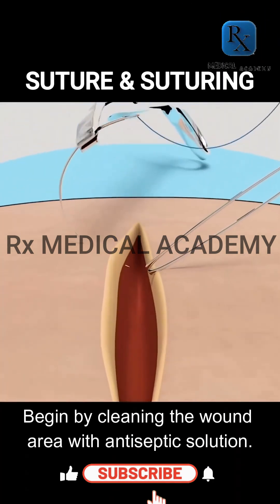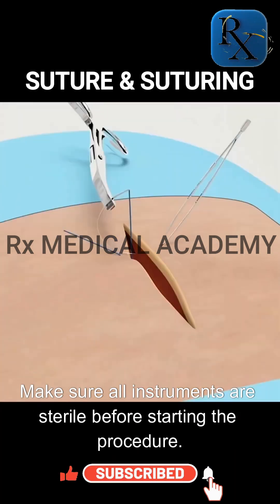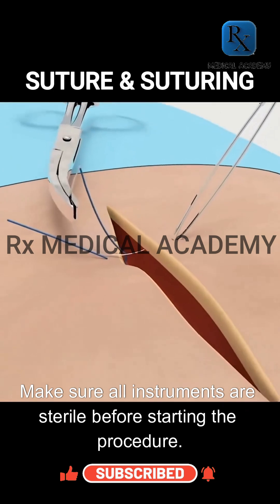Begin by cleaning the wound area with antiseptic solution. Make sure all instruments are sterile before starting the procedure.